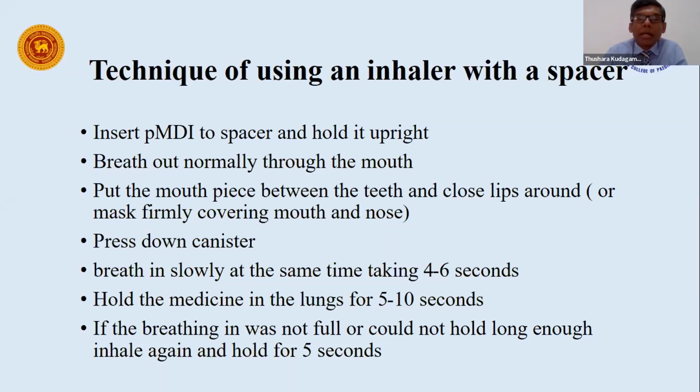Take about 4 to 6 seconds, or maybe 5 seconds, taking a slow breath in, and hold the medicine in the lungs for 5 to 10 seconds. And if you feel that you have not taken a good breath in, or you were not able to hold for 5 to 10 seconds, then you can do the same, hold for 5 seconds.